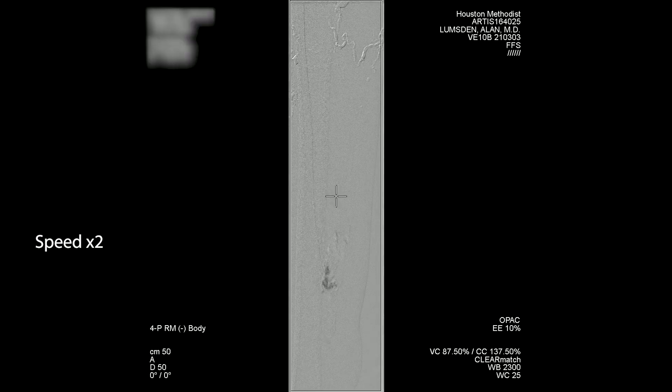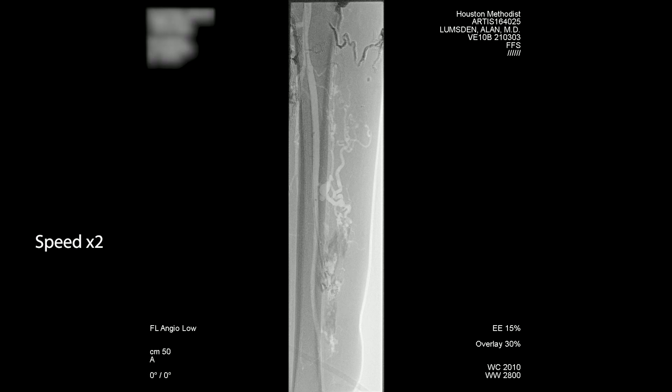You can see at the top of the screen is the old onyx — it just looks like this black cast of the blood vessels, which is one of the reasons this stuff is really nice to work with. Pretty safe. It tends to push distally. If you find it's starting to back up, just stop, wait, let it polymerize, and then push again. If it's refluxing back towards the axial vessels, you can aspirate on the syringe — a negative pull will actually control the onyx and get it away from areas where you might get in trouble.